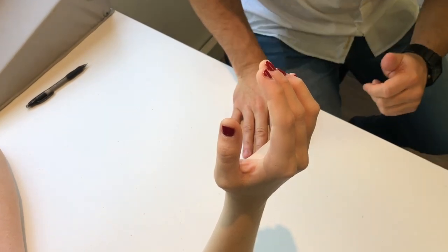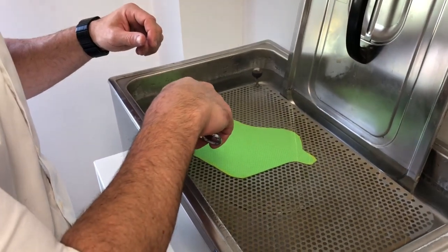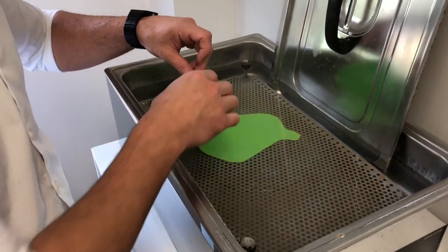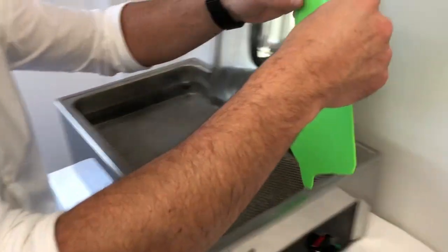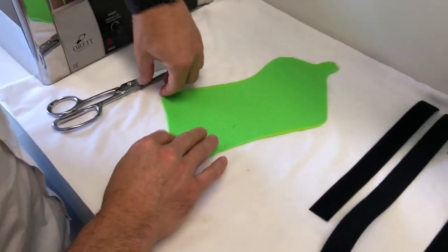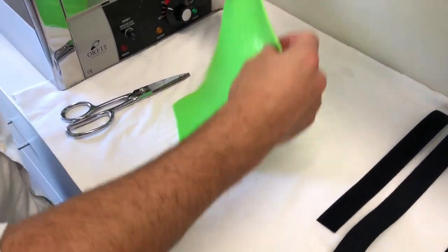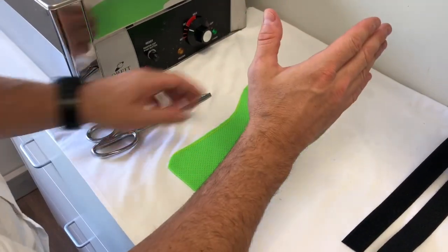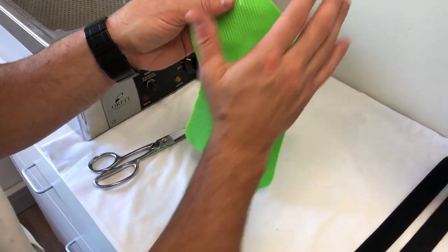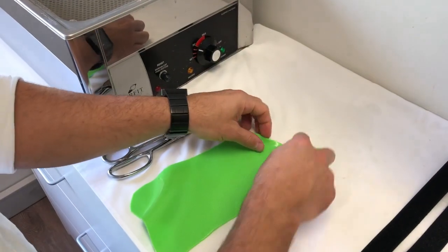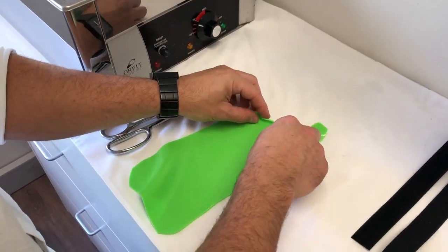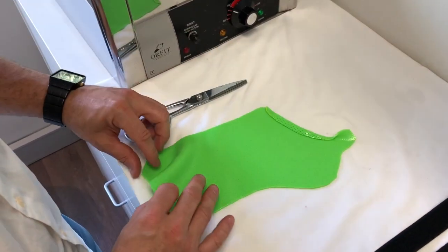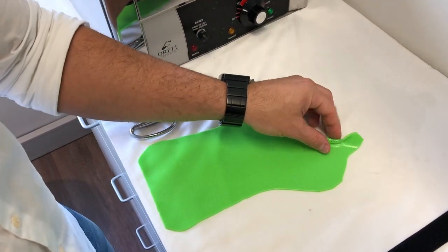Our thermoplastic should be ready now. So we're just taking our thermoplastic out of the water, drying it off. This one's going on a right hand. We're just going to fold our distal edge, our distal palmar crease, ready to put it on our patient.